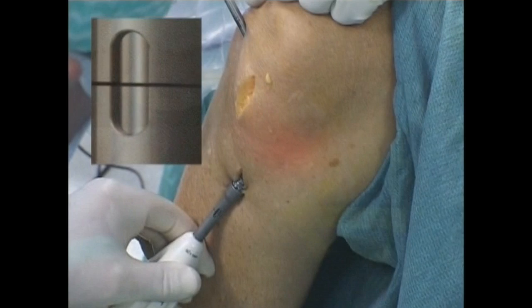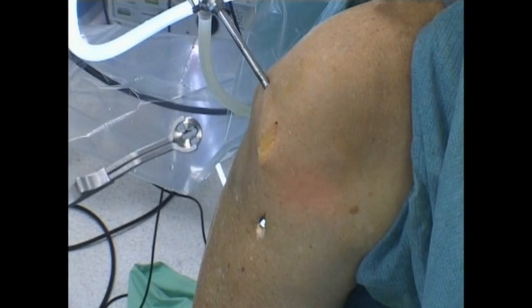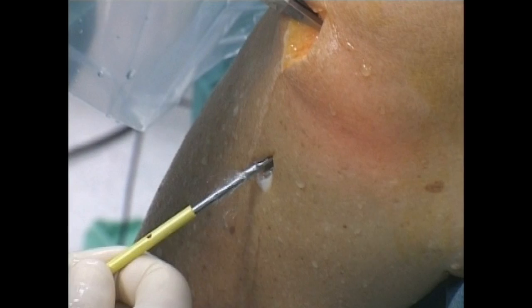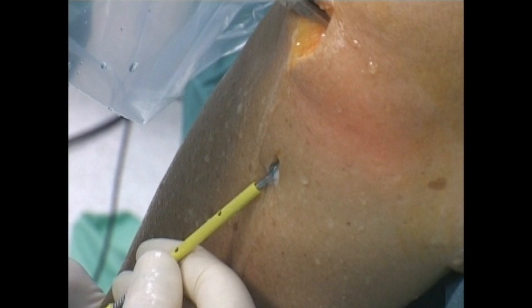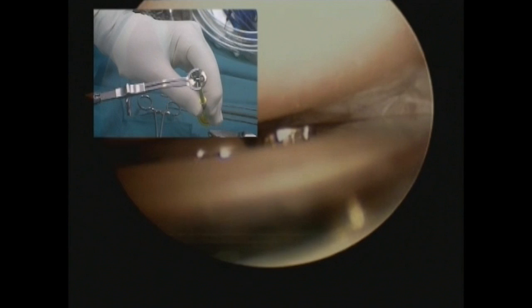The blade stop driver and the introducer are advanced as one unit. The blade stop is at the correct depth when the tip of the introducer is flush with the tibial plateau and the laser marks on the driver and the introducer are aligned in the slotted window. The tibial cutting blade is introduced through the anteromedial portal with the long slot facing posteriorly to the joint. The blade drive shaft is moved through the tunnel until it is visible in the joint. Push the tip of the drive shaft through the centre of the cutting blade. Connect the cutting blade to the blade drive shaft by turning the drive shaft 90 degrees and pull distally to engage the blade.